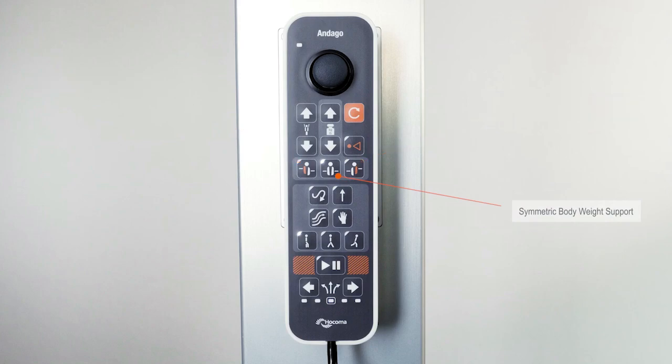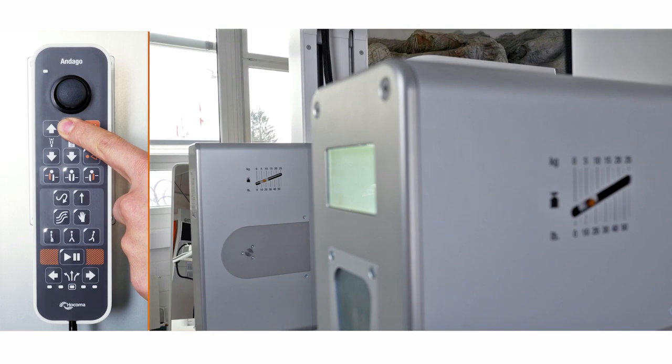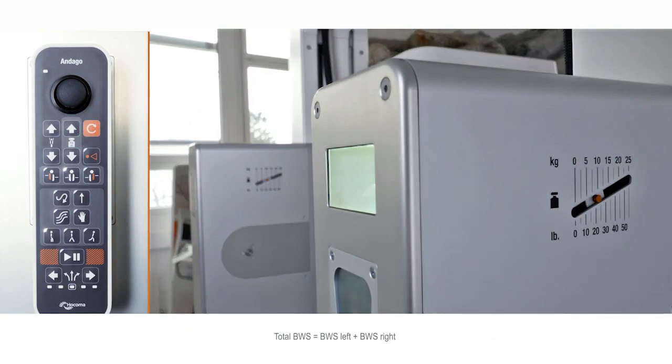Symmetric body weight support is selected by default. Simply increase or decrease the amount of body weight support and it will be applied on both sides equally. Remember, the total amount is the sum of both sides.